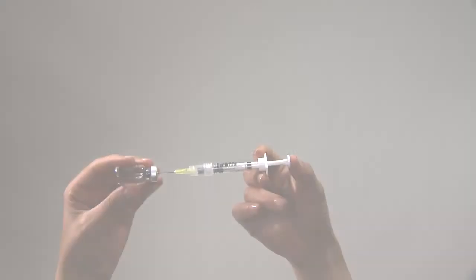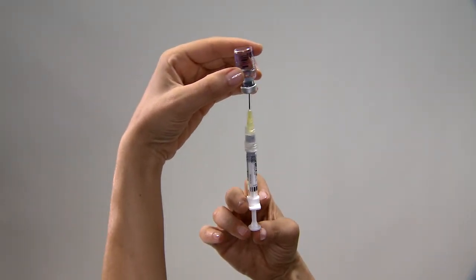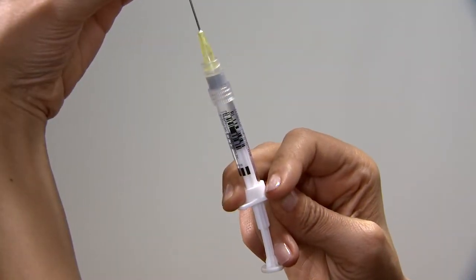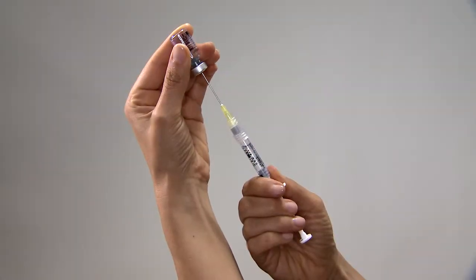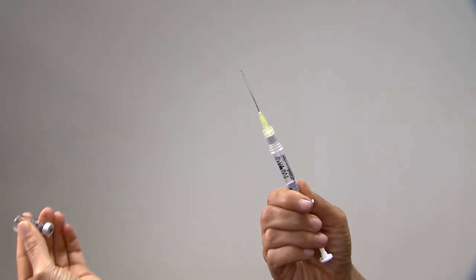Step 2. Preparing your injection. Keep the needle inside the vial as you lift the vial and turn it upside down with the needle pointing upward. Slowly pull back the plunger until the syringe fills with the total contents of the vial. Carefully remove the syringe needle from the vial. It is important to withdraw the entire contents of the vial.